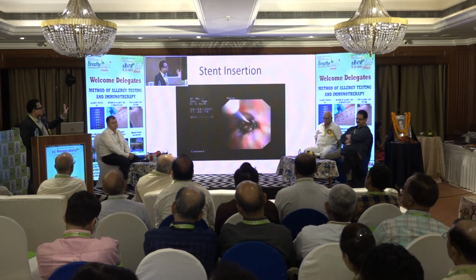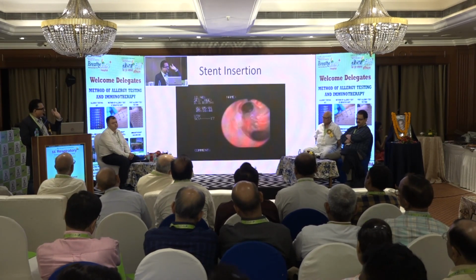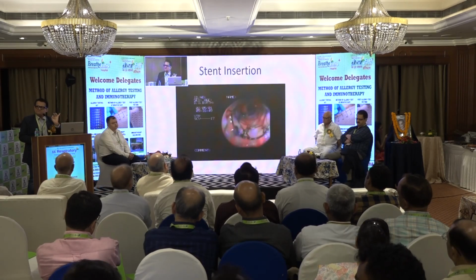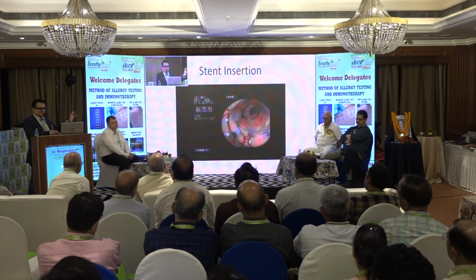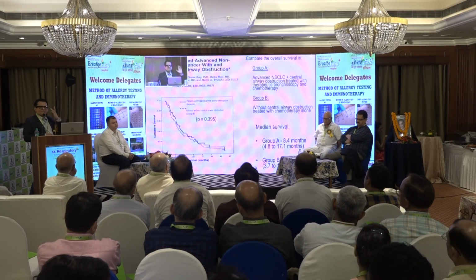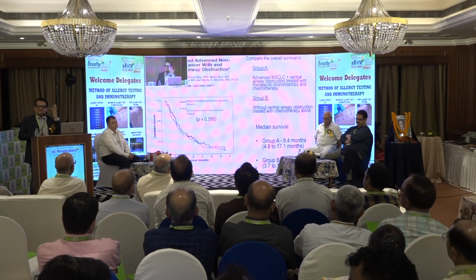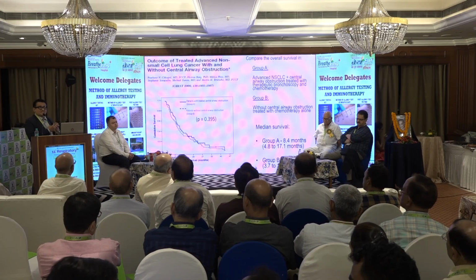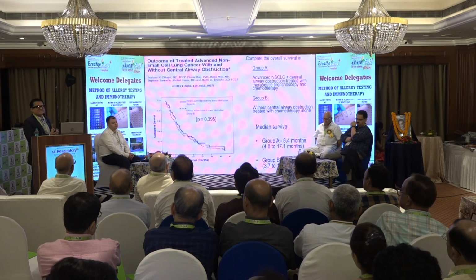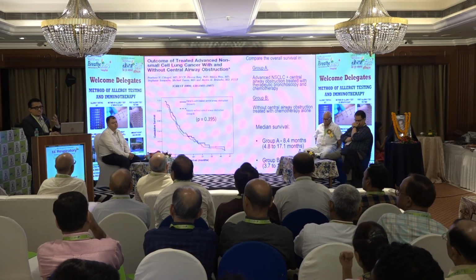I'd like to show this video. Look at this. The UltraFlex stent continues to be one of the better metal stents in selected patients with lung cancer. And you see how the airway completely opens up. This is the paper published in Chest. We showed that if you use lasers and stent placements, these individuals can have a good survival and they can also qualify for good chemotherapy.